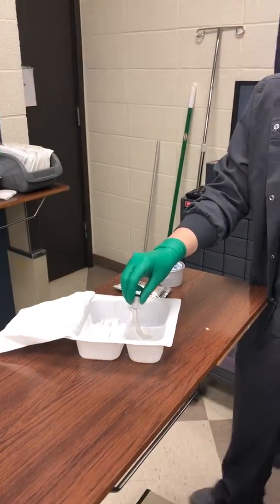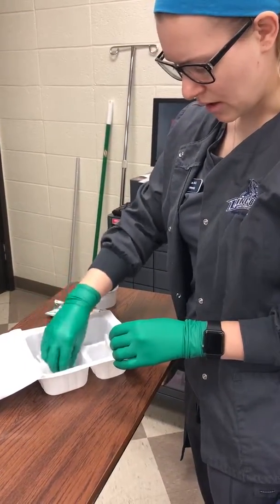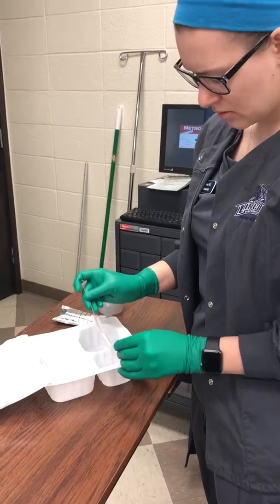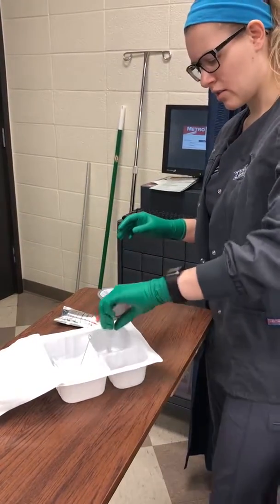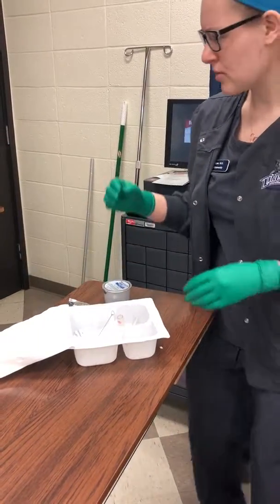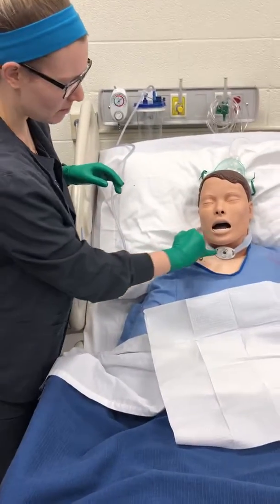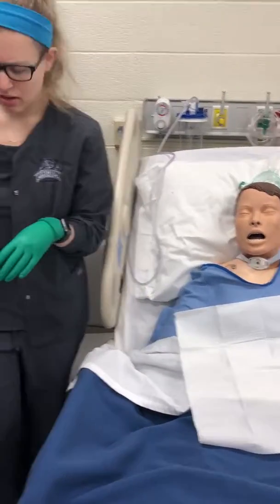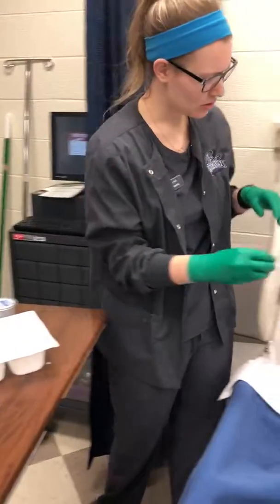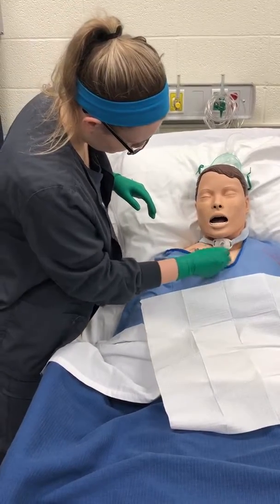And then you can put it in here. I can use a pipe cleaner and clean it out. Keep it nice and cleaned out, and then put it in there. And then I can use some gauze to wipe around and wipe some of the gunk off of this plate if it gets stuck on there. And then we can put this trach back in there. Make sure it snaps.